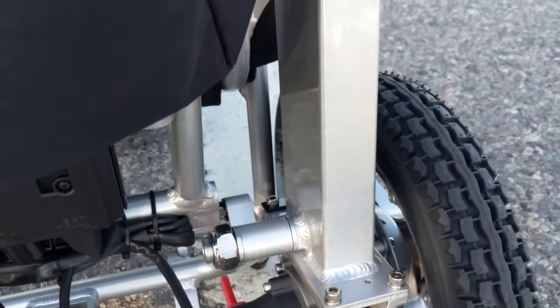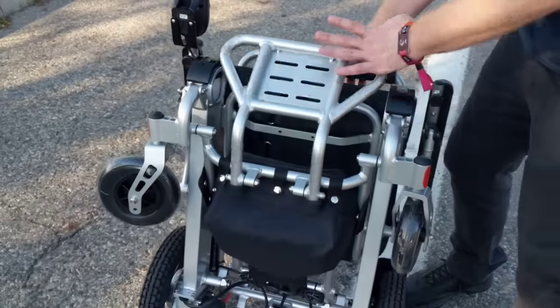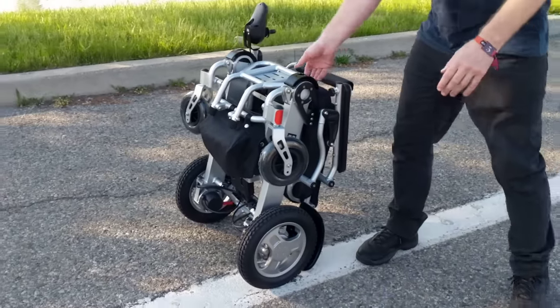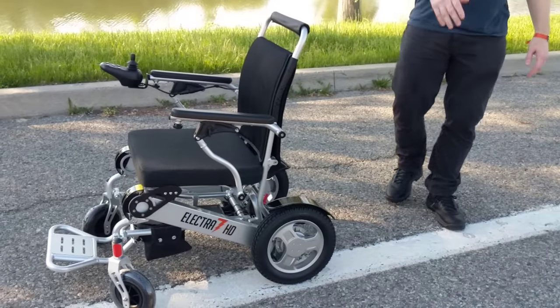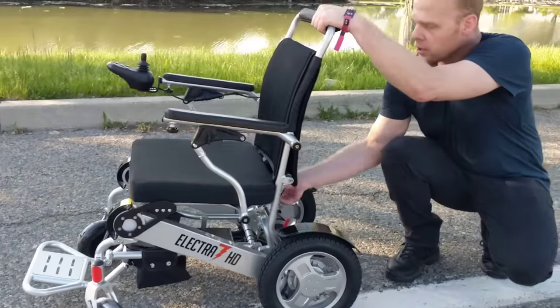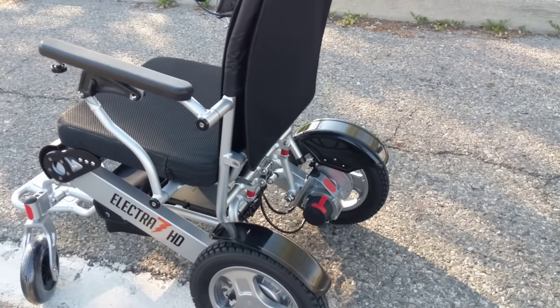We're going to unfold the chair. To unfold it, I'm simply going to grab the footrest, grab the back of the chair, push it forward, and pull my hand back. Look at that — less than a second, the chair is unfolded. The chair is ready to roll.